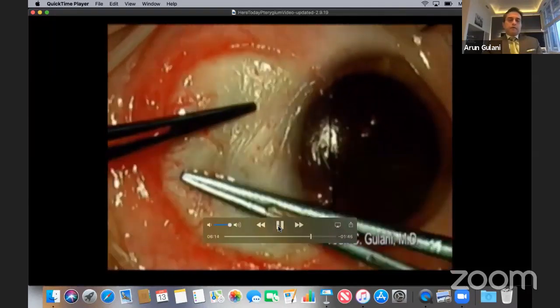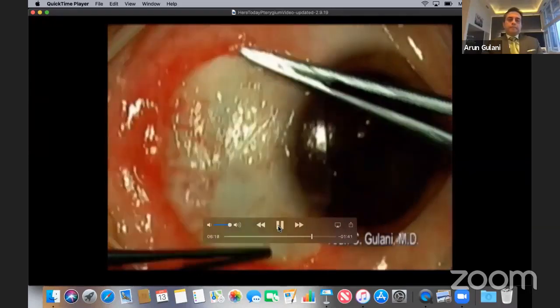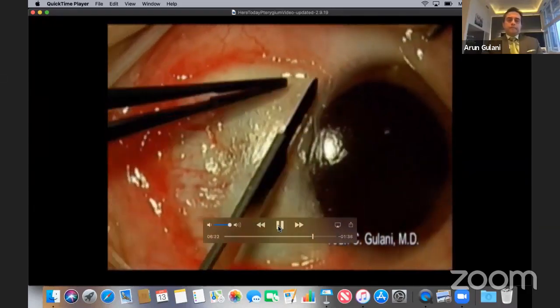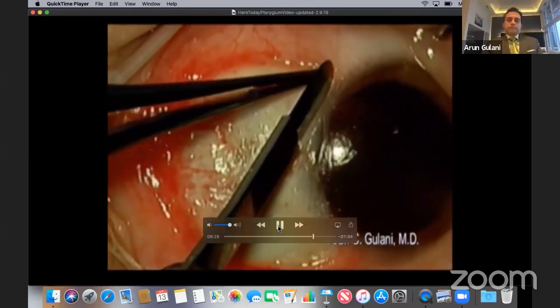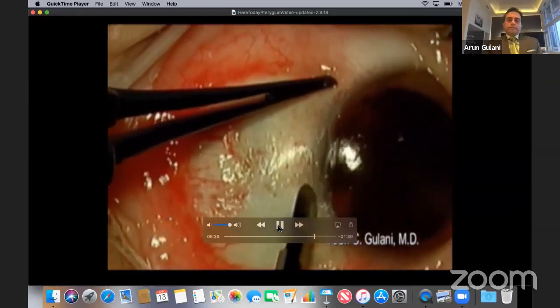Once again, sweep into place, squeegee at the same time so we have great adherence and placement. And excessive glue removal. Sweep the fornices. Using the blade, once again, trim the amniotic graft right at the limbus for a very elegant appearance and functional outcome.